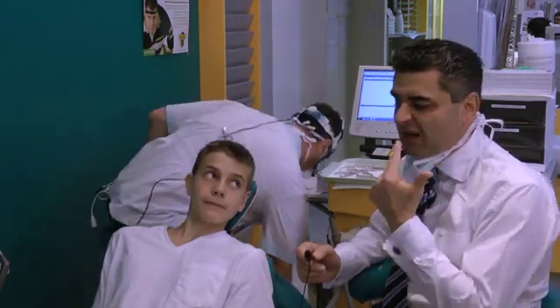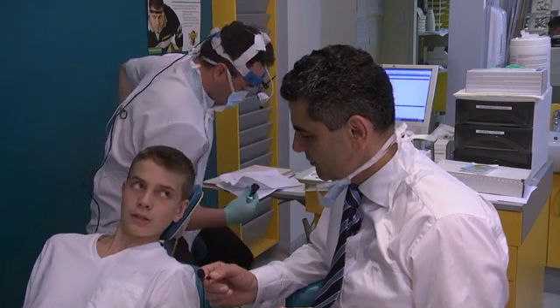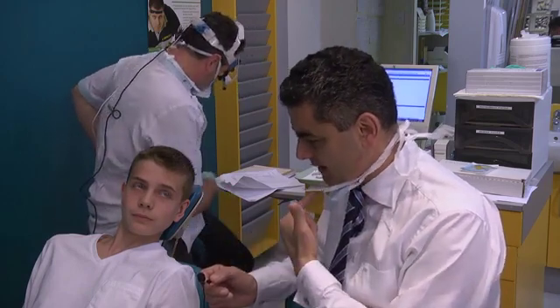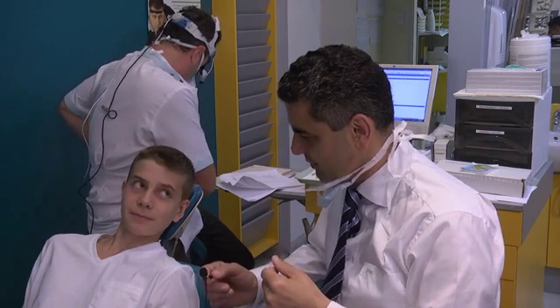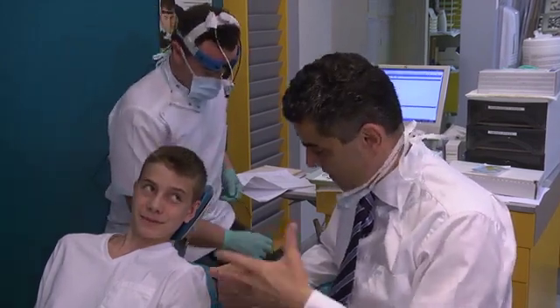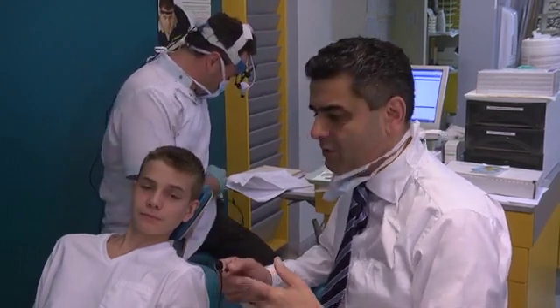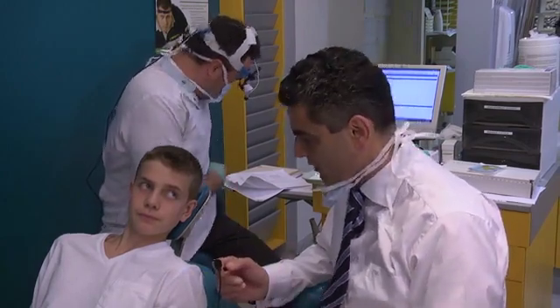Regarding the four braces on the top and bottom teeth, Oliver had a really deep bite so we had to put some bite-block putty on the back teeth so that when he bit down, he wouldn't break off the lower braces. Final instructions: keep wearing the appliance as you have been doing, and I'll see you again in about six months. If it's not fitting properly or falling out at night before then, come in early and we can adjust it.